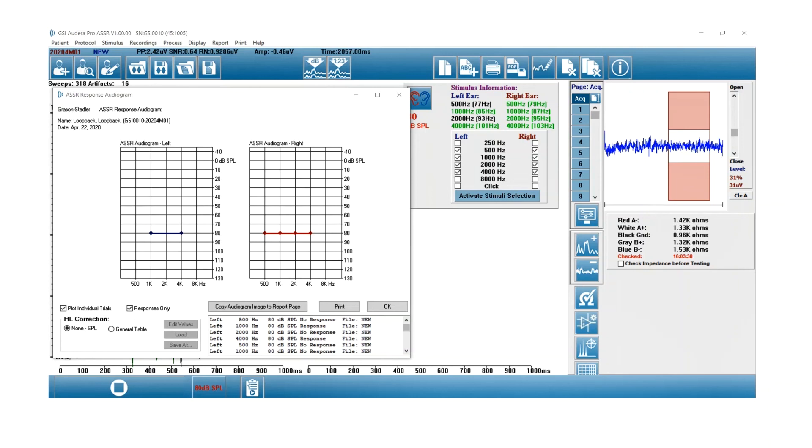As you're proceeding through the test, I'm still at 80 dB. If you're getting significant responses for a patient, you would certainly stop and go down in intensity.